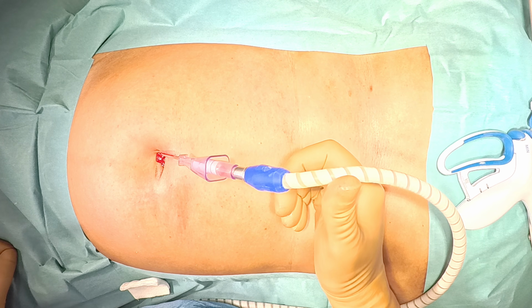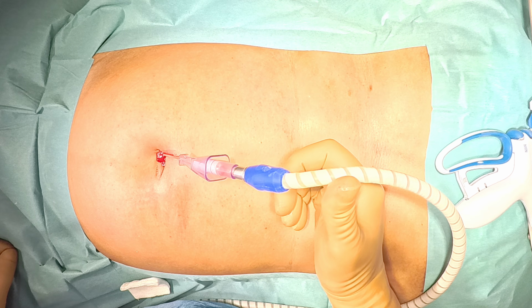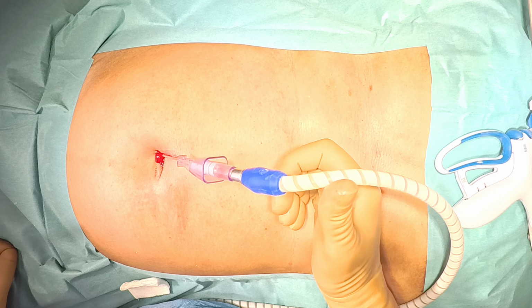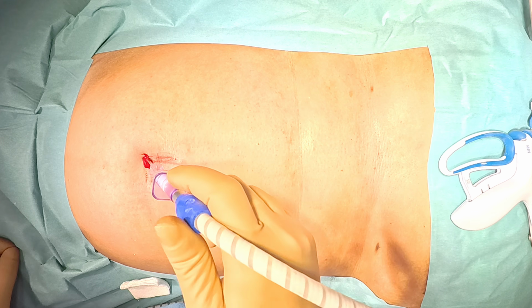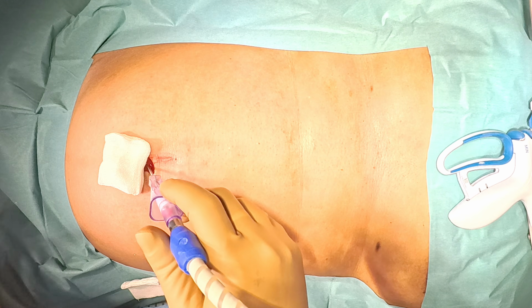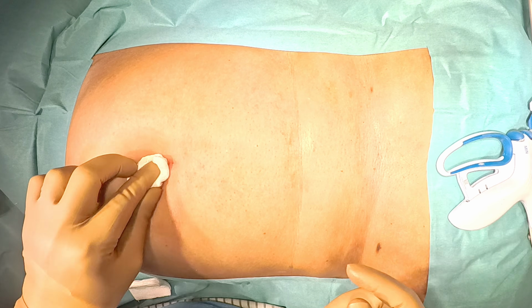So, this is only a two-port cholecystectomy. We will put one 10 mm port. One 10 mm port is necessary because removal of the gallbladder will be done through the umbilicus, and we will put only one epigastric 5 millimeter port for the sealing of the cystic duct and cystic artery. For the traction of the gallbladder, we will use the Stryker mini alligator that will hold the fundus.